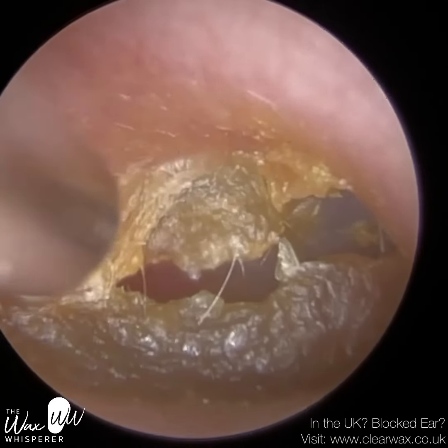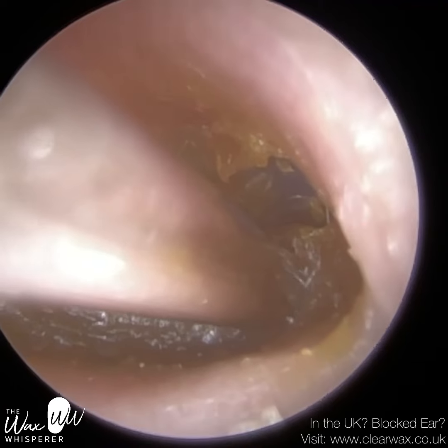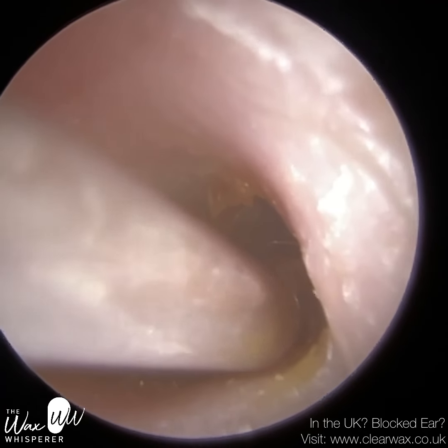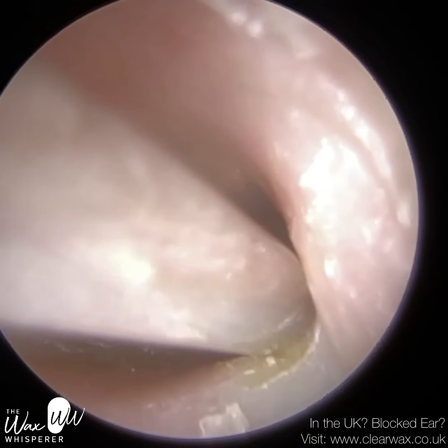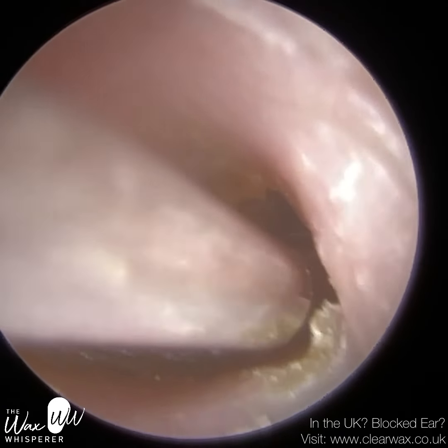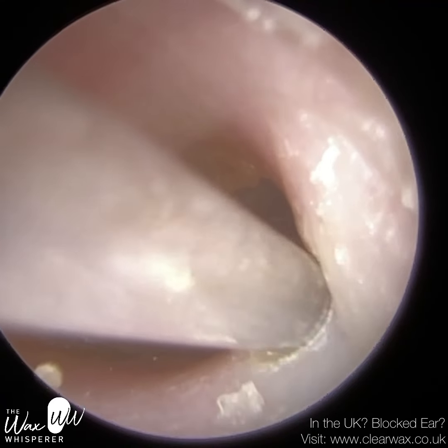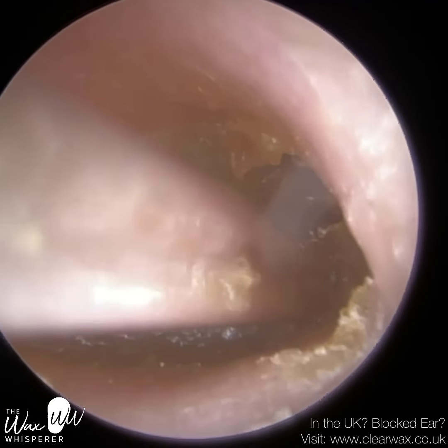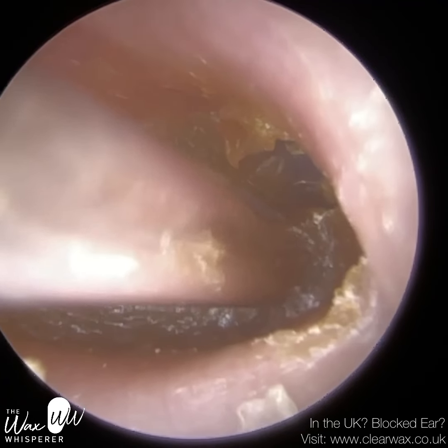They are also a hearing aid wearer, and their main symptoms caused by this crusted hard skin were that the hearing aid was whistling — they were getting acoustic feedback. When I first inspected the ear, this skin looked a bit soft, if truth be told, and I thought it would be pretty straightforward to remove.